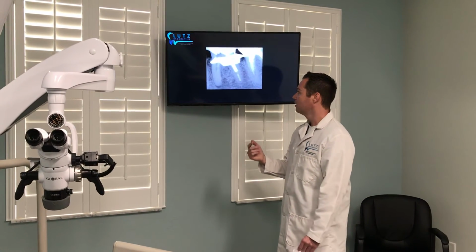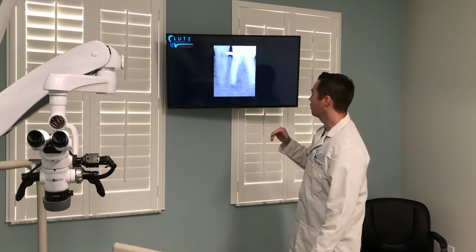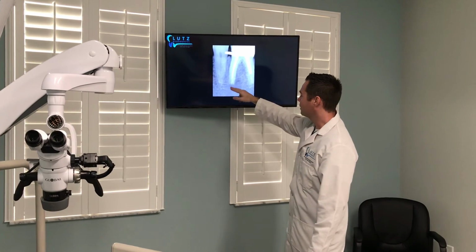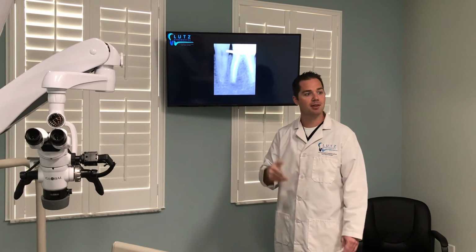Next slide. We take a master cone shot, showing that we were able to clean to the very end of that root. You can actually already see a lightening already occurred, maybe in the beginning stages of bone formation. Go to the next slide.